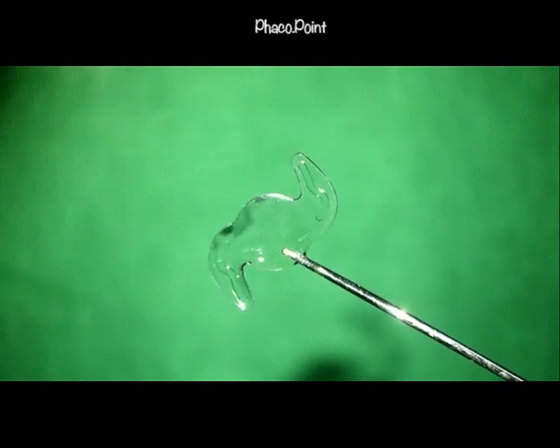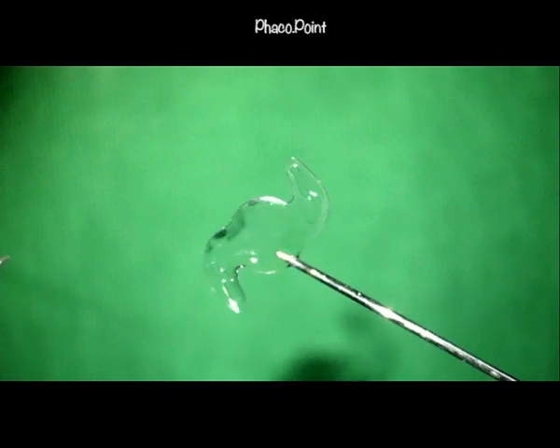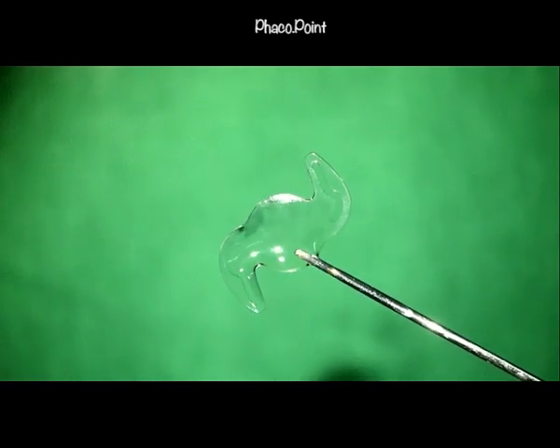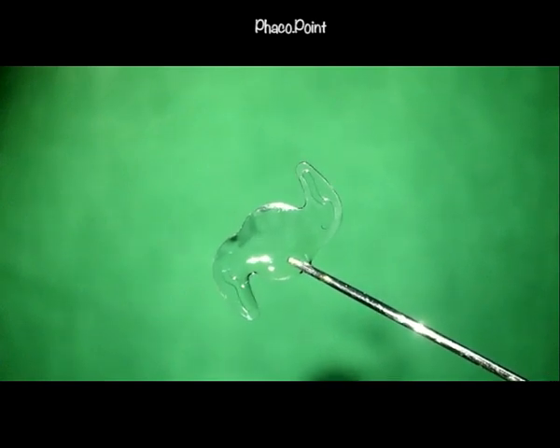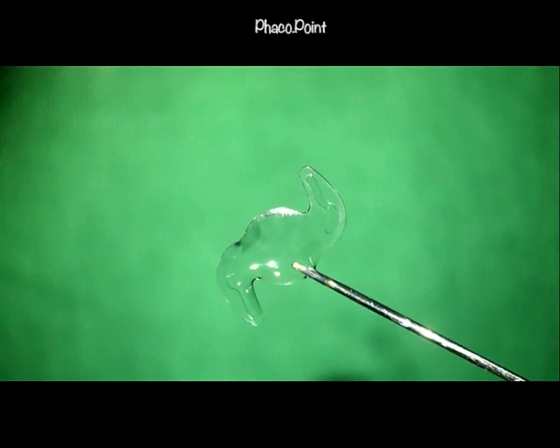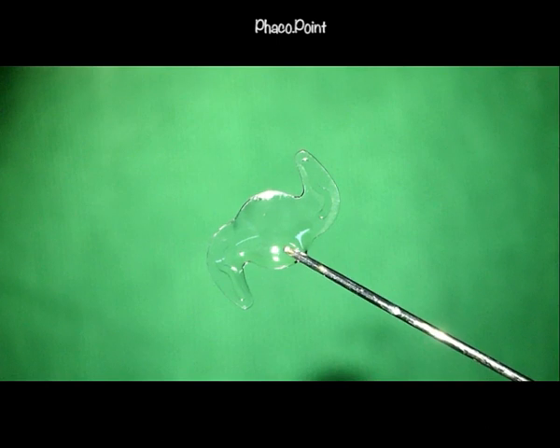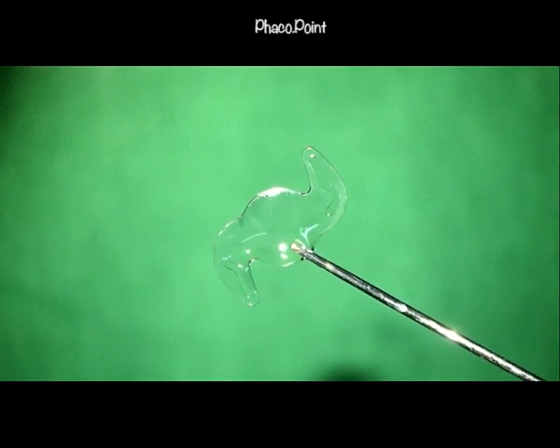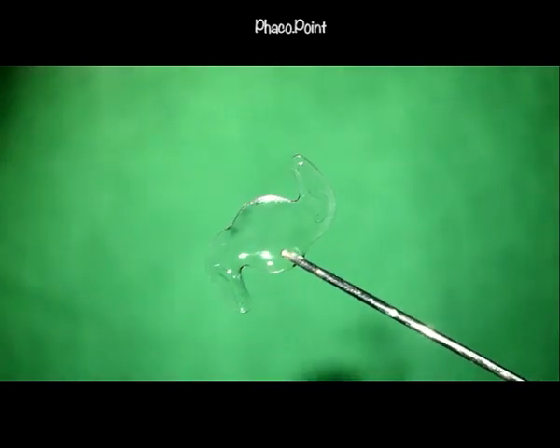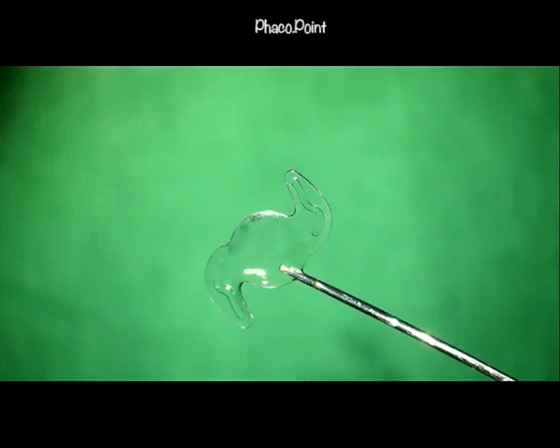Let us now understand the optimal orientation — that is, how the lens should be placed in the eye and how it should be held prior to cutting it in the anterior chamber. As a left-handed surgeon, I would hold the lens with my non-dominant right hand. The grip on the IOL needs to be firm, and until the lens is cut, we should not let go of this grip.